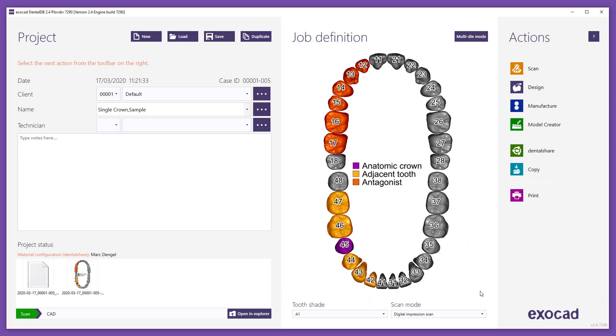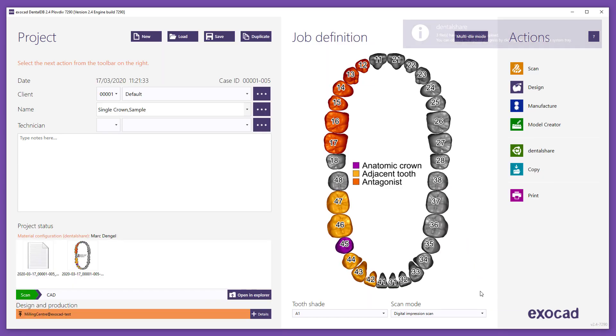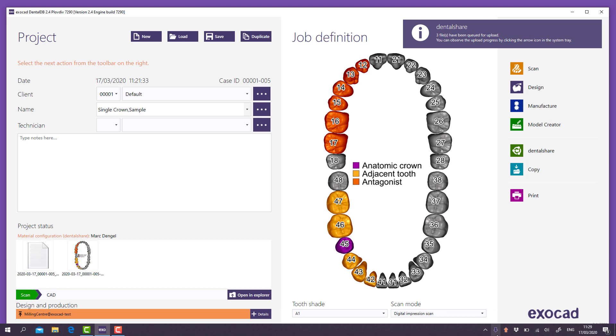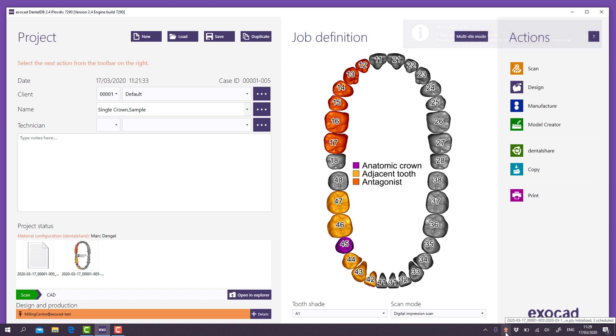While sending and receiving data, different status indicators and symbols appear. Uploads and downloads are performed via the DentalShare server and their status are indicated by arrow symbols in the taskbar. Orange arrow points out that the upload or download is in progress. Purple upload or download arrows shows no activities. Red arrow indicates an error.